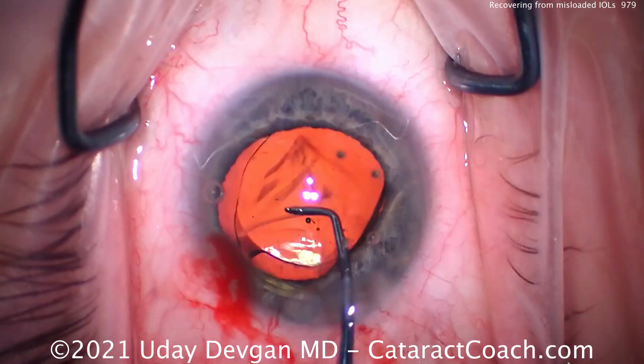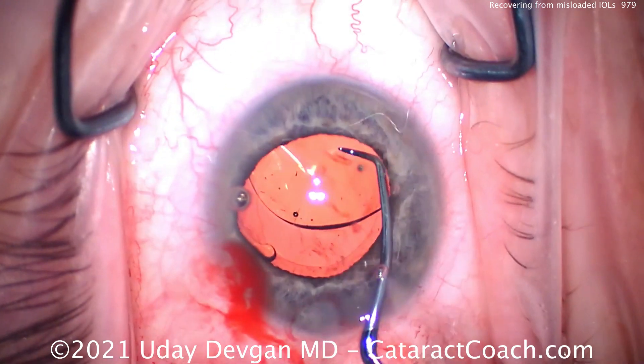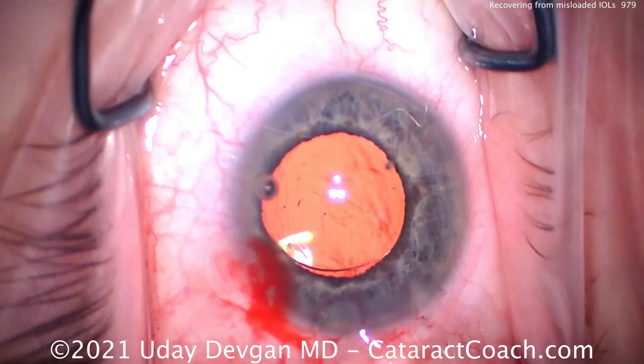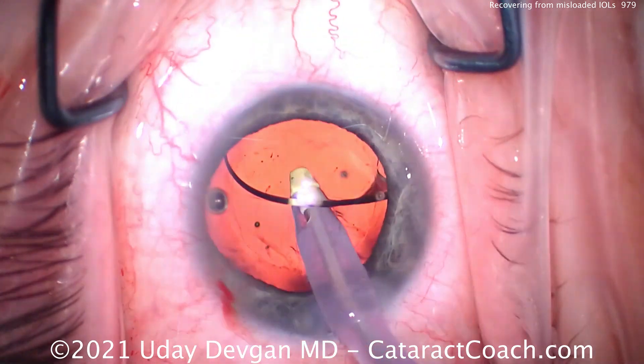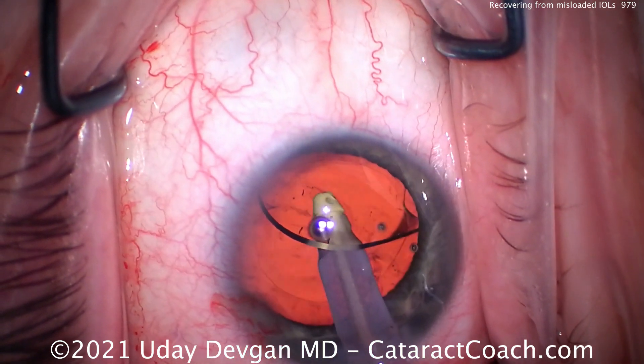So now we'll get that leading haptic in the capsule bag using the chopper, and the trailing haptic goes in too. These lenses are pretty tough and nearly indestructible, so that looks pretty good. And now we've got the lens in the capsule bag. Let's take out the viscoelastic — going behind the optic, removing viscoelastic. That looks good.